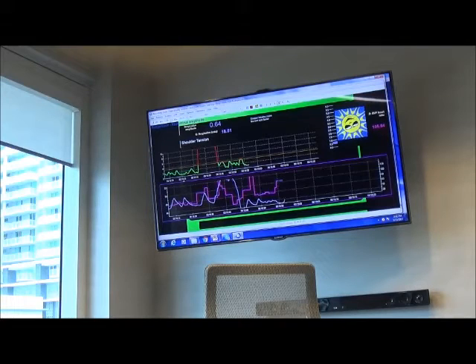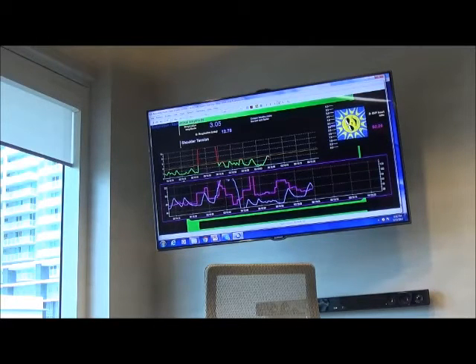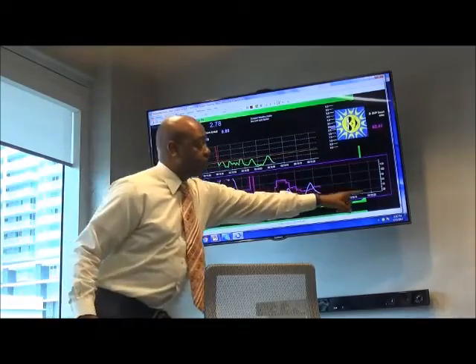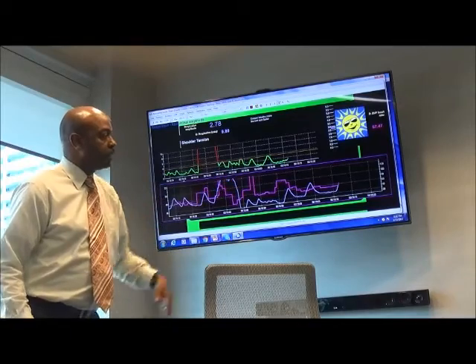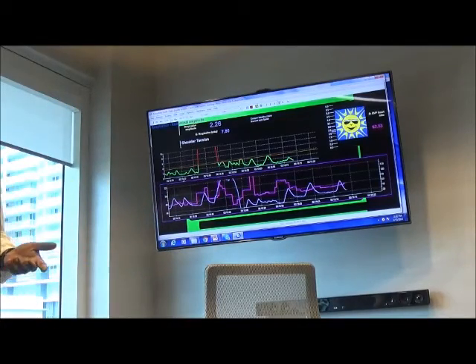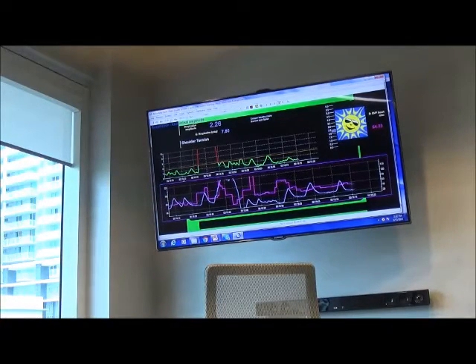And it is going to be blue in all the screens. Okay. Respiration. So we were saying that you might want to change the graph for heart rate because it's from 20 to 130. So it would be more reasonable maybe to make it... between 40 and 100.